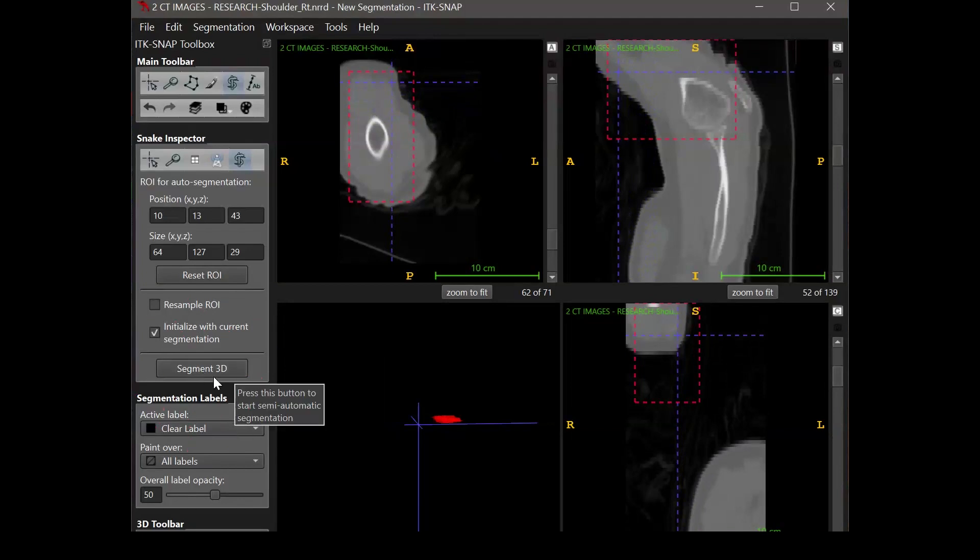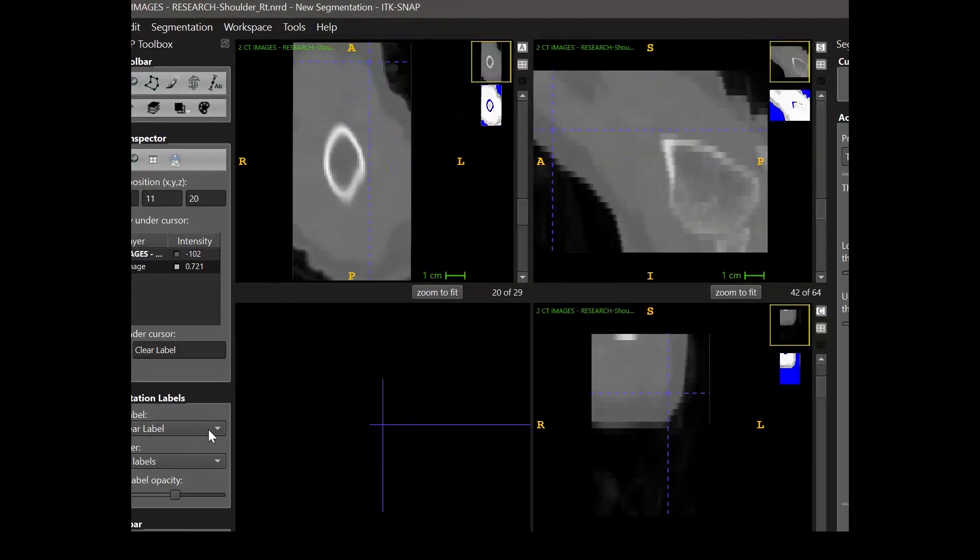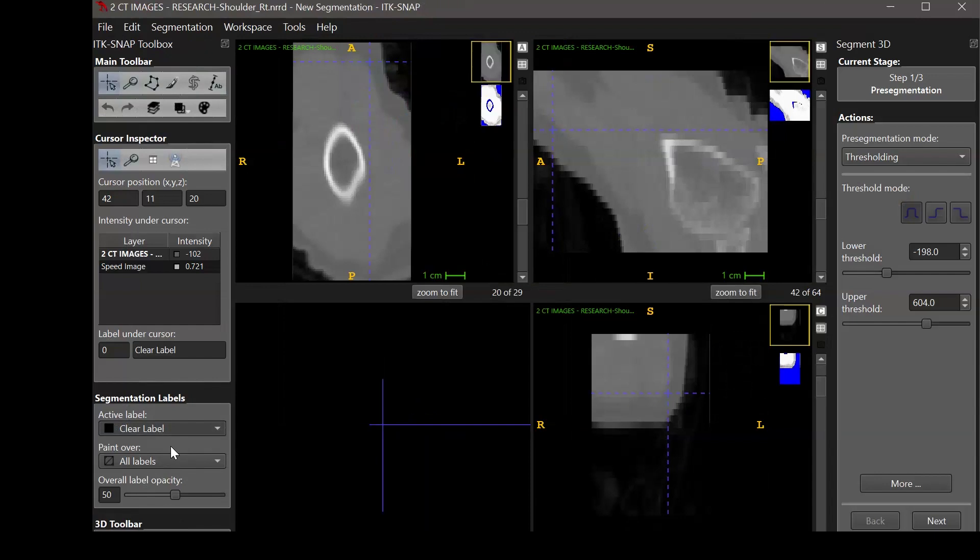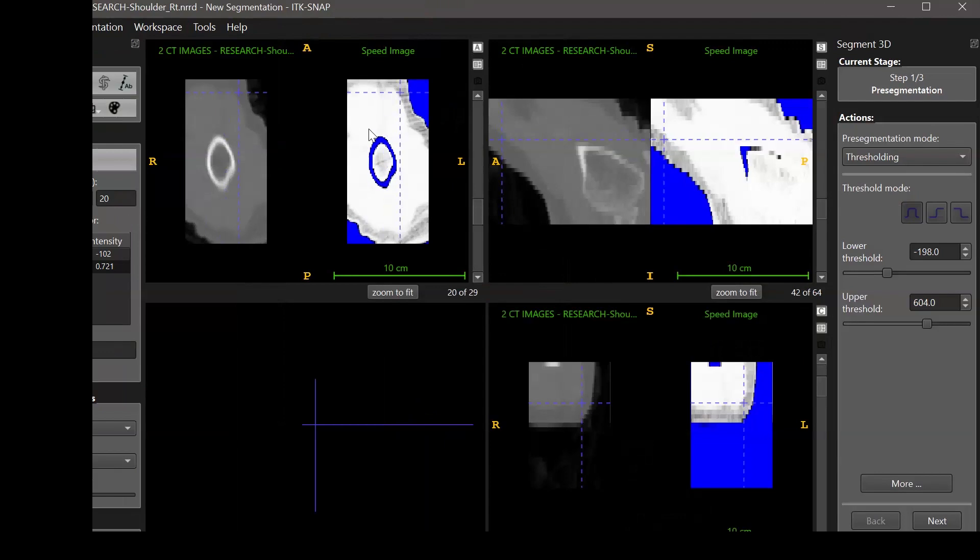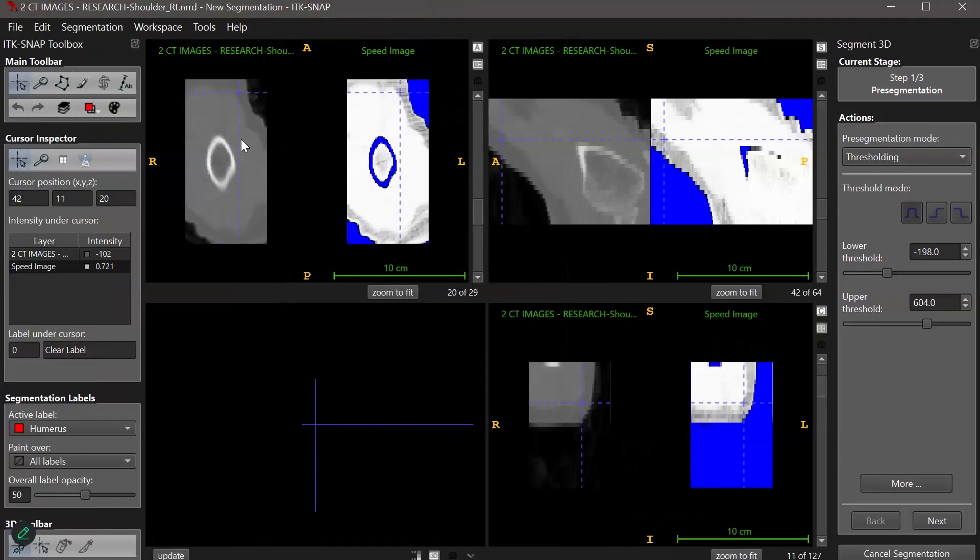Select the label that you want to focus on. So I will focus on just the humerus from now on. The next step is called pre-segmentation. In pre-segmentation, you want to set threshold values based on the cutoff for pixel intensity.